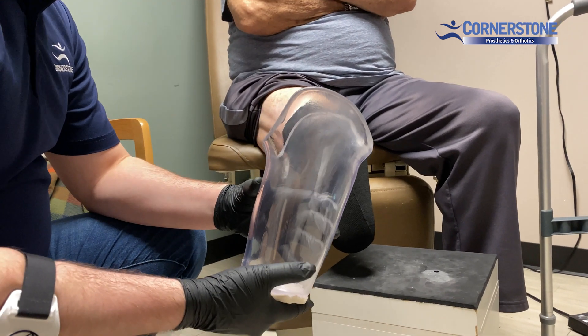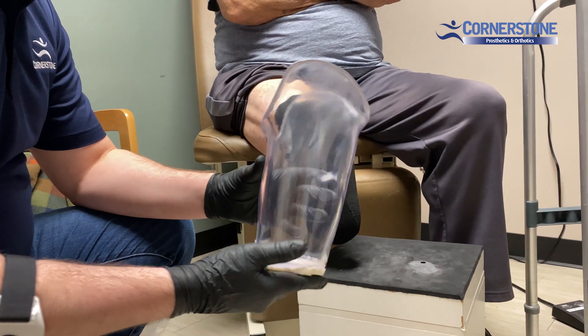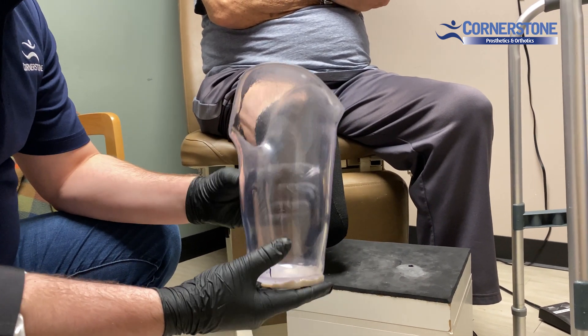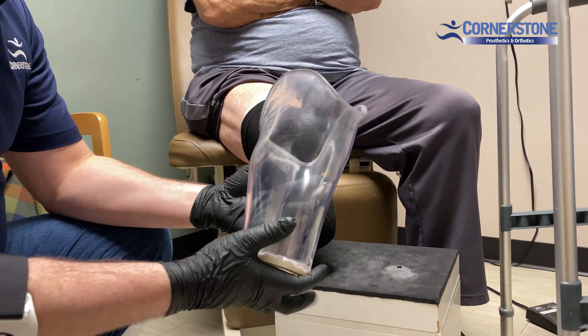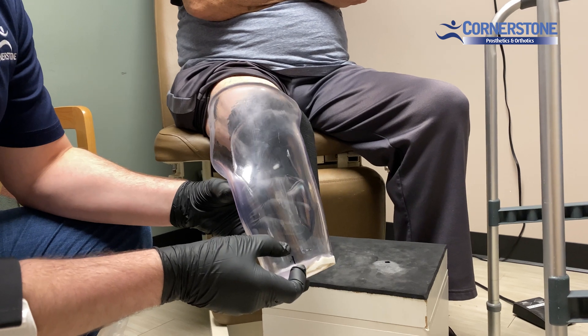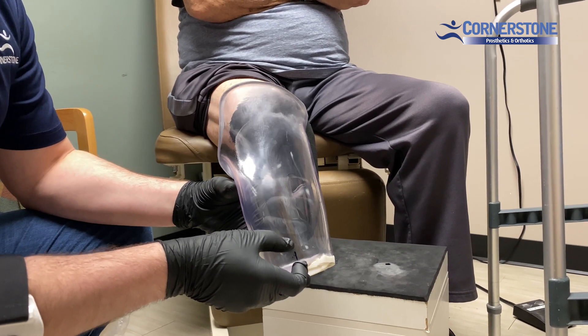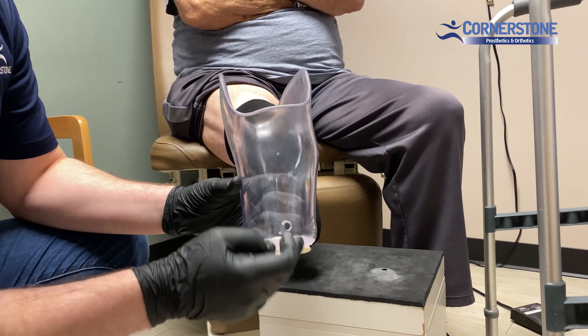Today we're going to be showing you how to do an injection molded silicone distal end pad for a BK prosthesis. We start with a socket shooting for a two to three ply fit, and we have space built up at the bottom for where the silicone is going to be injected and cured. We've put in a port in the back where we're going to inject it.